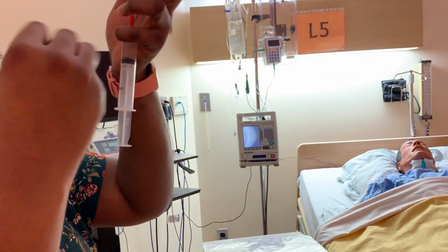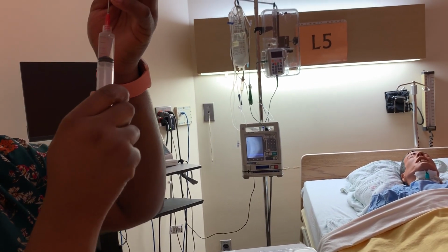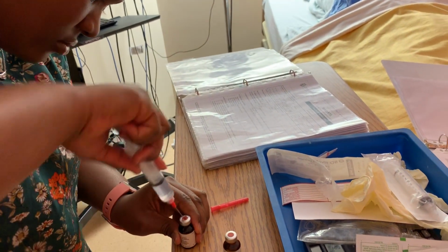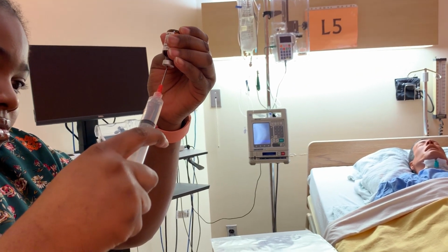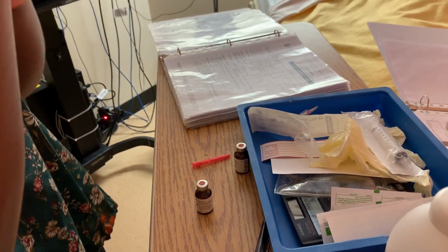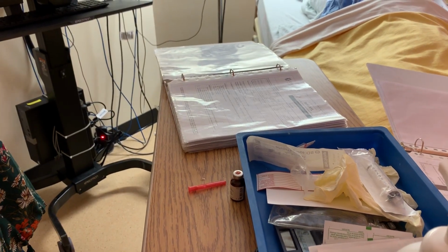So I'm going to get rid of those air bubbles there. Okay, so this is 5 ml. So I'm gonna also inject here, so I'm just gonna pull back on this to make it up to 10. So I didn't touch this again, so I'm just gonna inject it just to make sure I get up to 10. So I'm gonna inject the air.